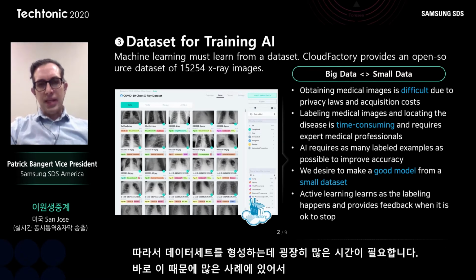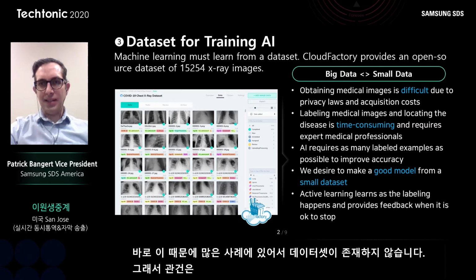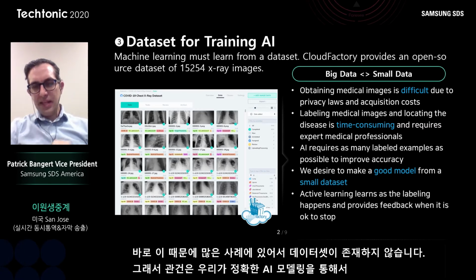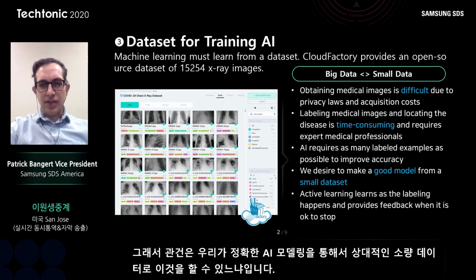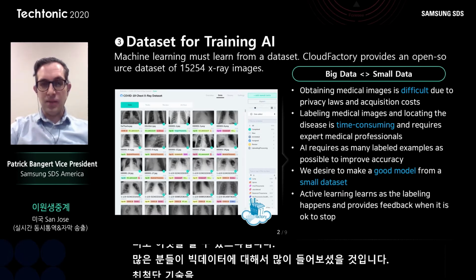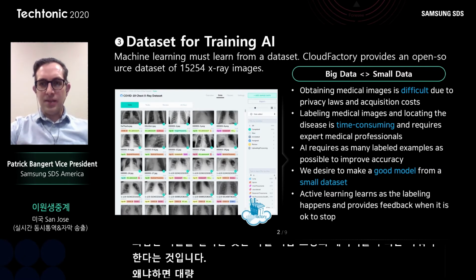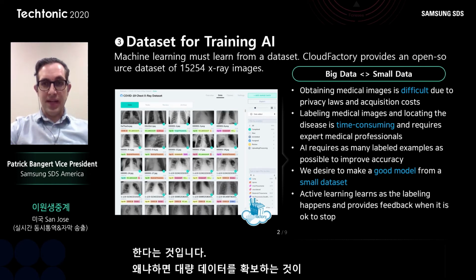And so a crucial problem that underpins all of this is, are we able to learn an accurate artificial intelligence model based on relatively little data? So the past couple of decades, you've heard many things being said about big data. Actually, the state of the art right now is to look at small data, because in many cases like this one, getting access to more data is either very difficult, very expensive, or not possible. So in this case, we set ourselves this task.